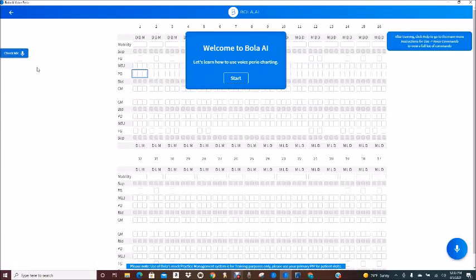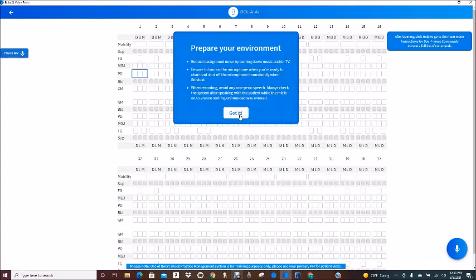The interactive training can be forwarded as a link to all of the clinicians if they want to do the training outside of the operatory or outside of the office. They will need both the link and the license key that comes in the welcome email from Henry Schein. This is just letting you know to prepare your environment so that your voice is the most prominent voice in the room.